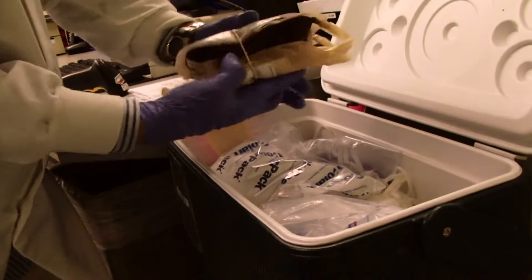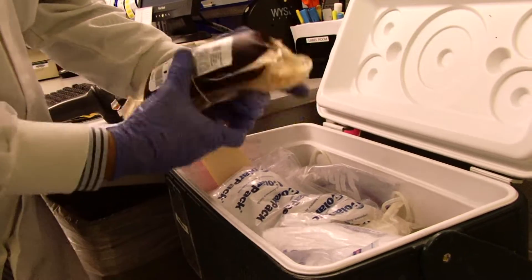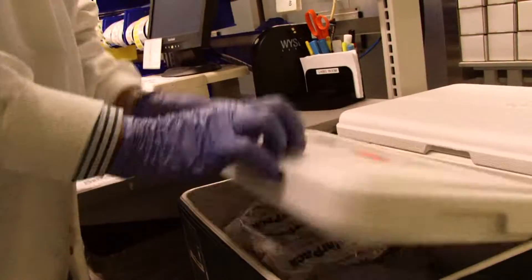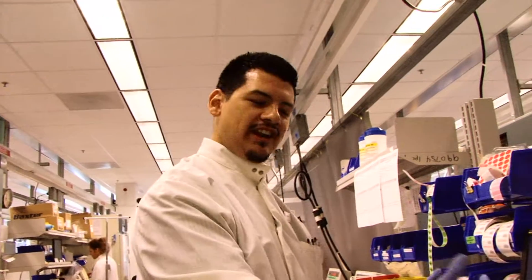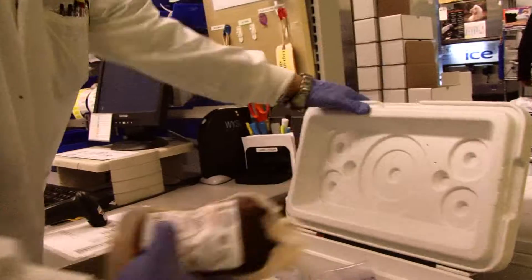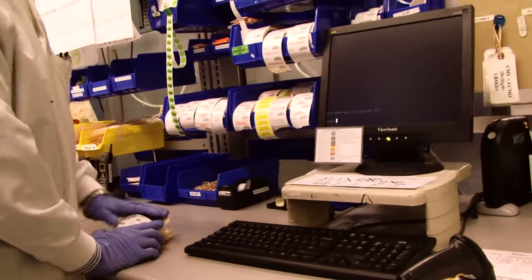Here we have blood that's just been donated from donors. They kind of wrap it up nicely for us — there's a certain way they need to wrap it. Basically, this just came from a donor, so what they do is they get inputted in the computer. That's medical records — they do that, and then we can access it and process it. The system will tell us everything we need to do with this unit.